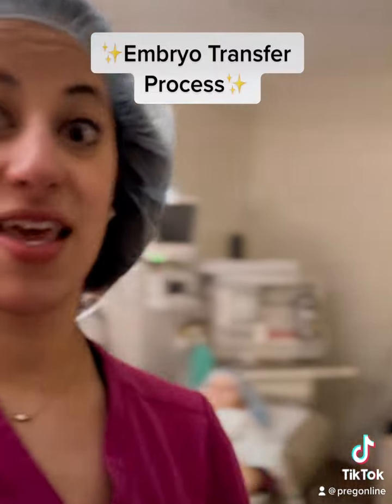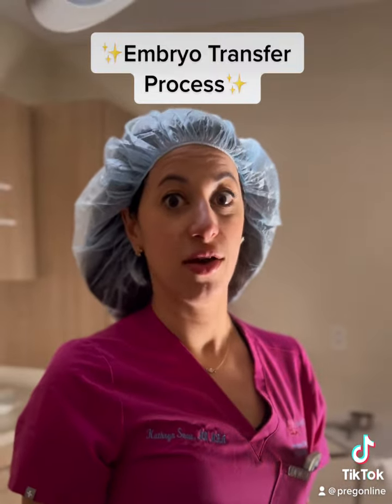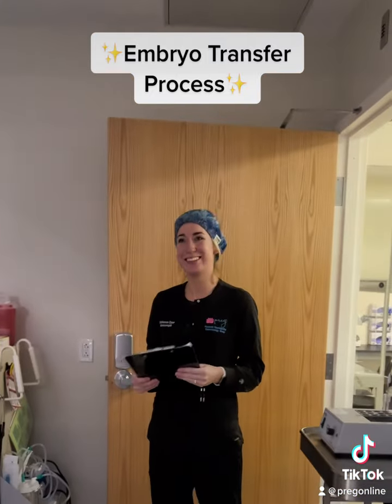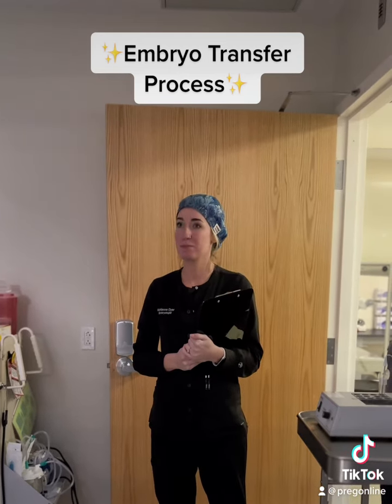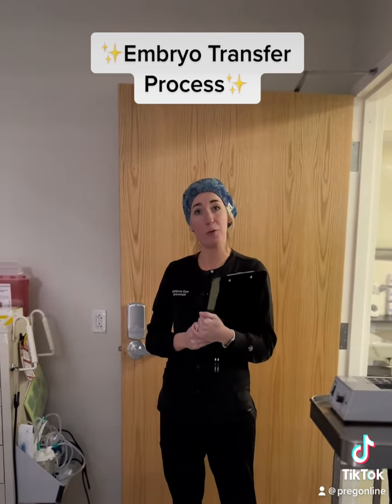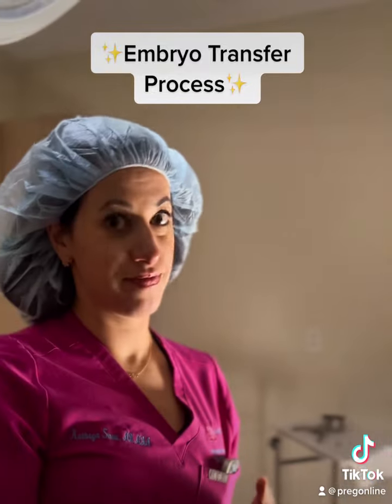Before we do anything, our embryology team would perform what we call a timeout. Say hi, embryology. Hello. This is McKenna, and before we do an embryo transfer, she would confirm the name of the patient, the time, date of birth, procedure, and anything else that would identify the patient before we proceed. This is to make sure we have the right patient and the right embryo.